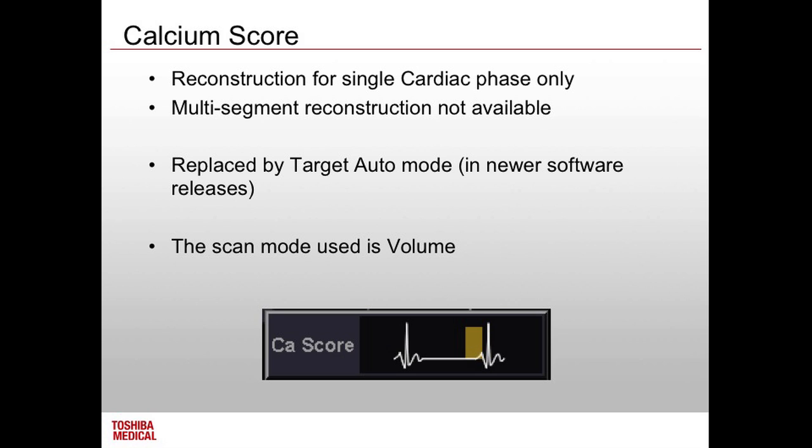And the other thing is, don't mess around with your algorithm, like your FC values. It'll be set up for you, but if you think, oh, I can get better image quality by going to a smoother algorithm, because we use really low dose on calcium scoring, don't do it, because it works on Hounsfield units. As soon as you change an algorithm, you can shift your Hounsfield units, and that can mess with the calcium score. Does everyone sort of get what that means?